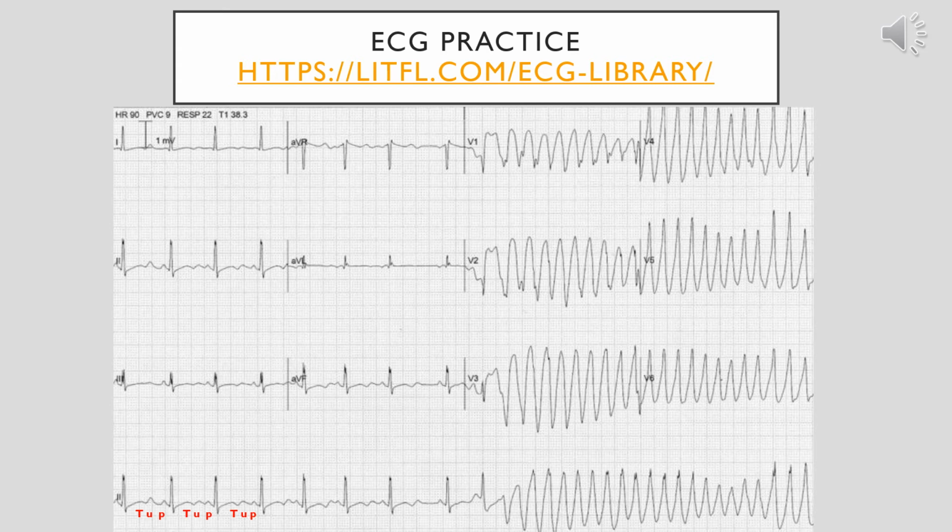Okay. Before that aberration, we do notice some changes looking at the waves. Over here I have the T, U, and P waves outlined. You can notice that there's a T wave, a distinct elevated U wave, and a P wave. Most of the time U waves can be undetectable. They're kind of eaten up by the T wave and you don't really notice them. Whenever you notice a prominent U wave with ST segment depression, you're going to want to consider the likelihood that there may be some hypokalemia. Hypokalemia will often cause a prominent U wave. Looking at the EKG strip at the bottom, you can see a pretty tall U wave preceding the P wave. So that's kind of a key indicator that this patient might be developing some hypokalemia.